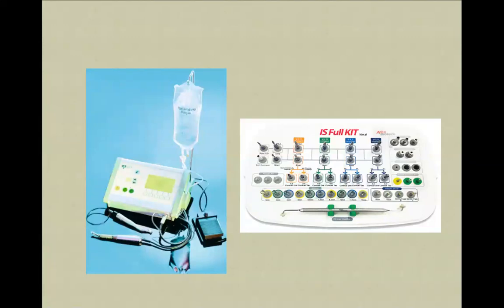Another, and here we have transfer screws, we have pre-taper, we have countersinks, we have stoppers. And also very important is that every company will provide the doctor with a kit that was designed for their implants. Like this one is Neobiotech.